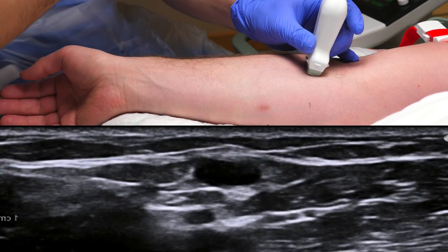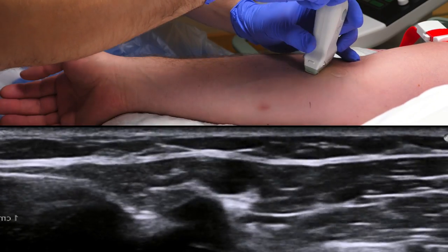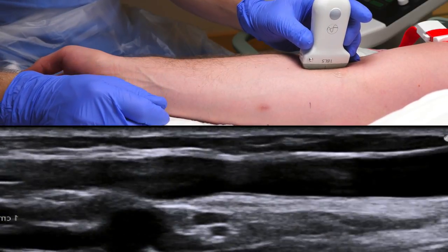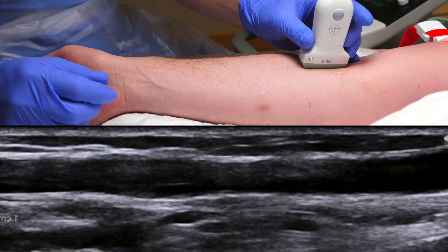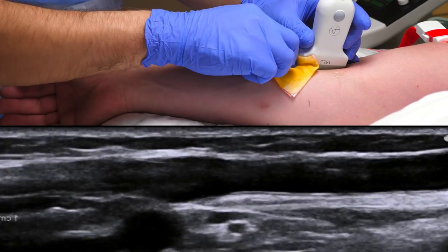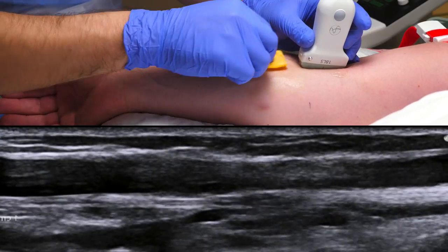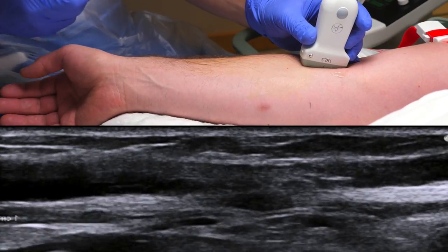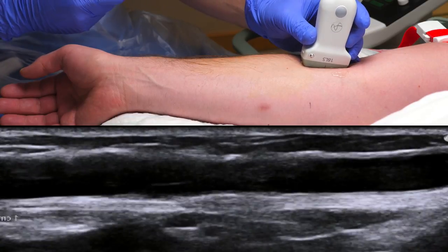We recommend using an inline technique, so we rotate the probe 90 degrees. This will give us a very clear picture of the long axis of the vein. Once you've found a good insert location, prep the area with a disinfectant. Note how we keep the probe completely steady and slightly tilted away from the point of insertion.